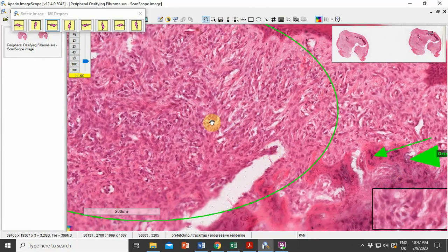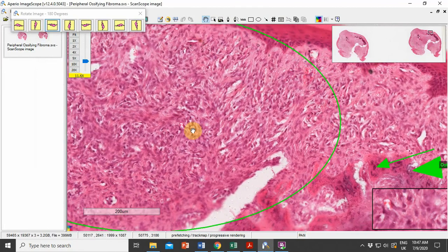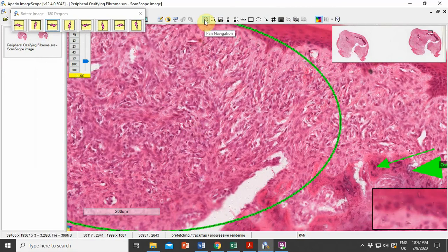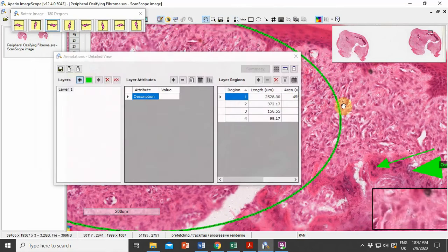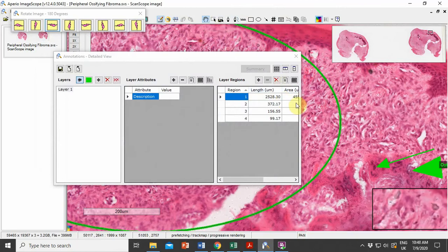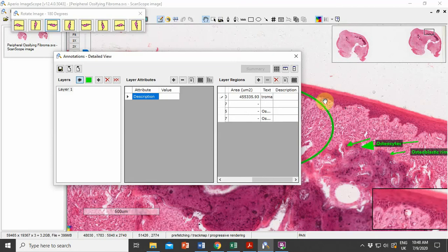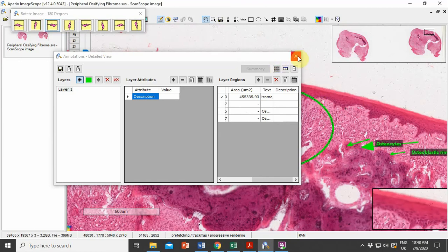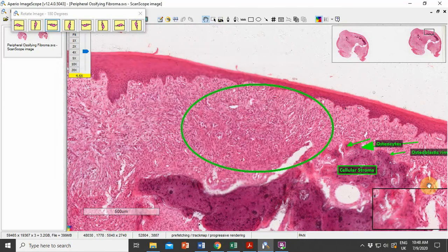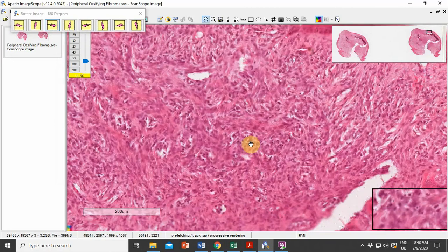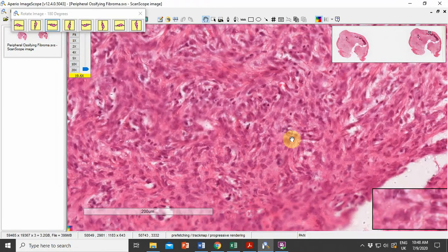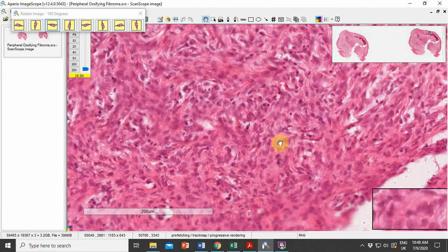The trabeculae are lined by osteoblastic rimming. The surrounding stroma, as you can see, is highly cellular and reveals numerous spindle-shaped cells with central nuclei.